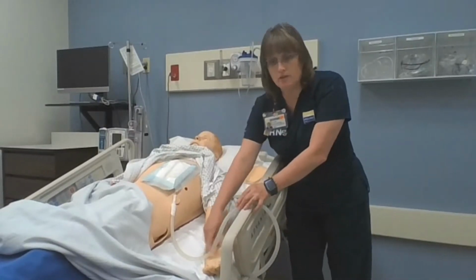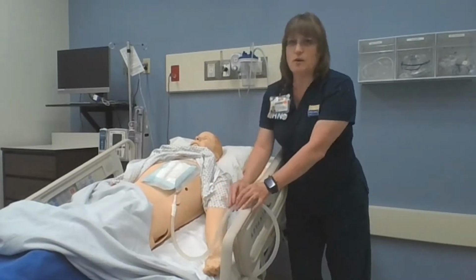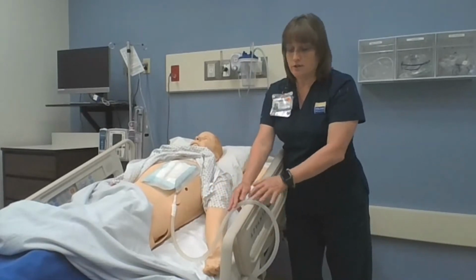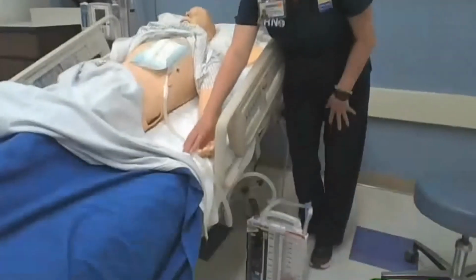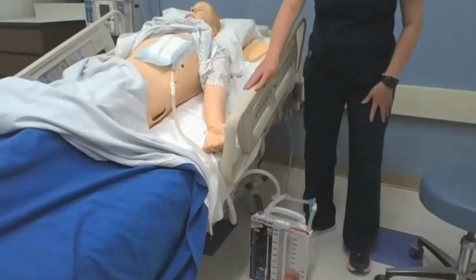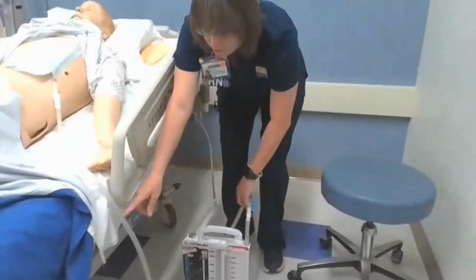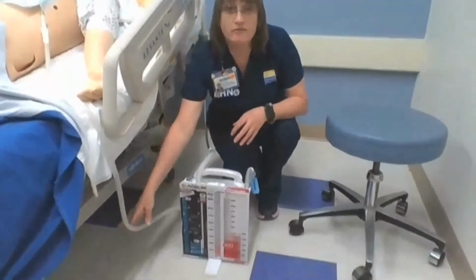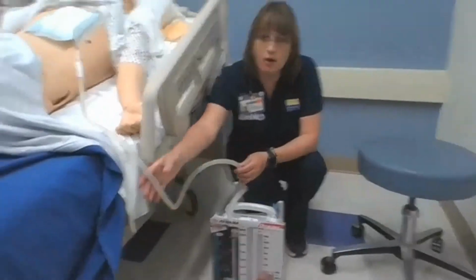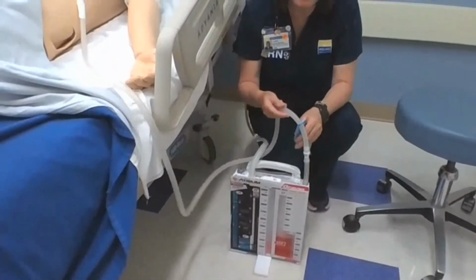You can have them with the chest tube. Notice the drainage is down, and typically you'll see it when it's going up and over a guardrail. So if you have a dependent loop, you just want to move that tube so you don't have that dependent loop anymore. I'm going to continue to trace my tube, and what I'm looking for is the type of drainage that I have. Okay. I'm looking to see, are there any clots or kinks? And then the next thing I'm looking for is my clamp.